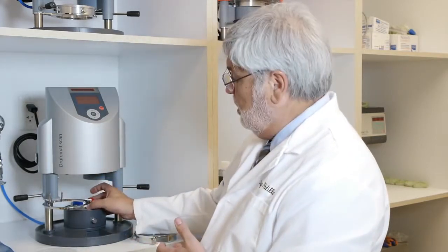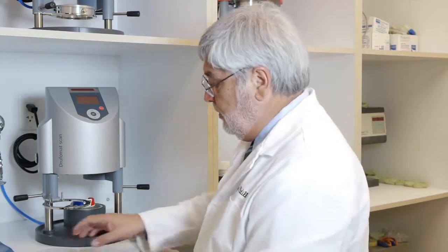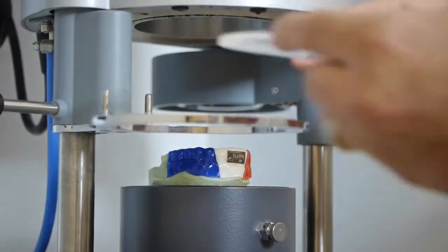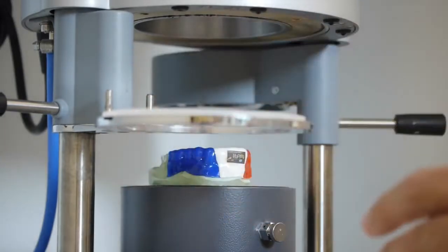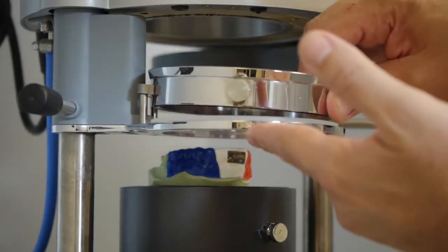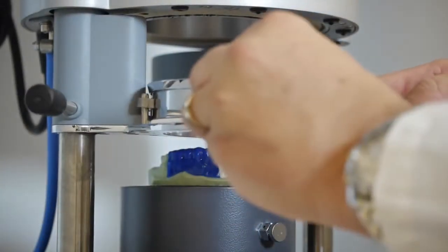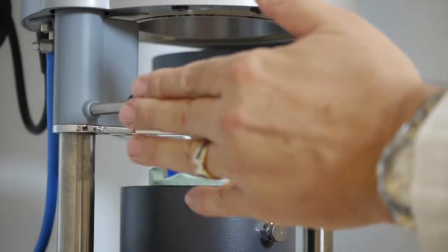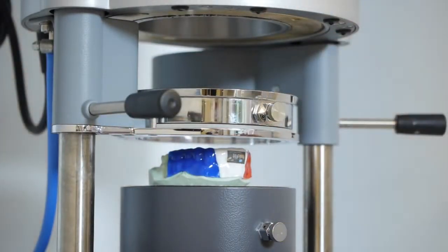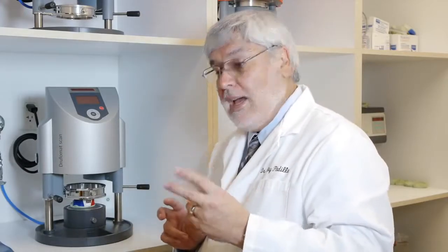Place the model on the tray. Here's our second layer of clear 3 millimeters. Place that on the ring. Line up our ring in the pegs. Set that material over the model. And now we're ready for our second scan.